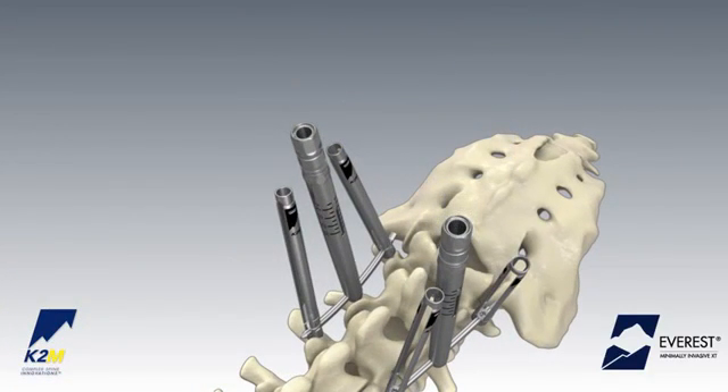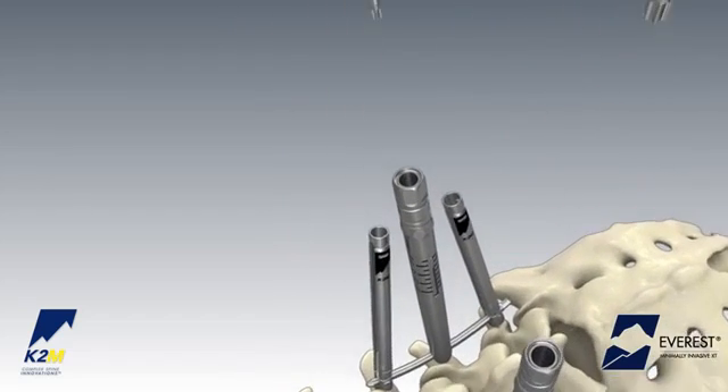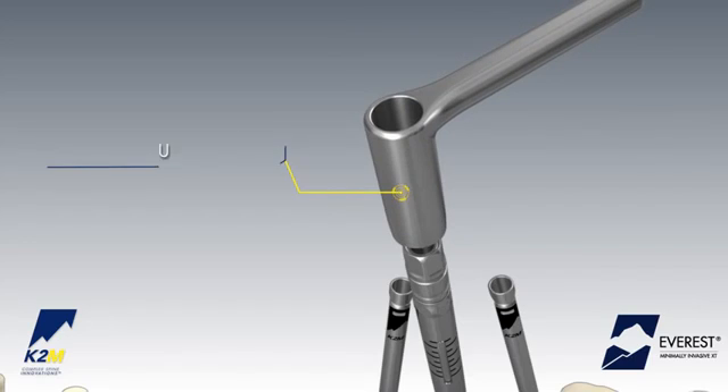Attach the set screw to the split tip provisional driver and insert it into the cannula of the tab reduction tunnel and into the implant housing. The tab reduction tunnel can be used to final tighten the set screw with the use of the anti-torque handle.